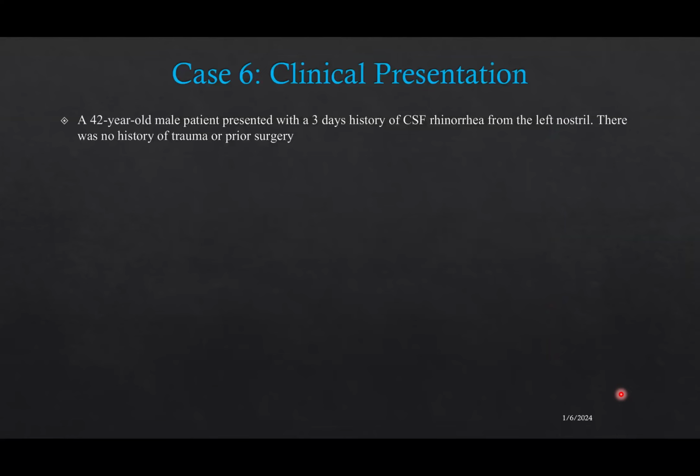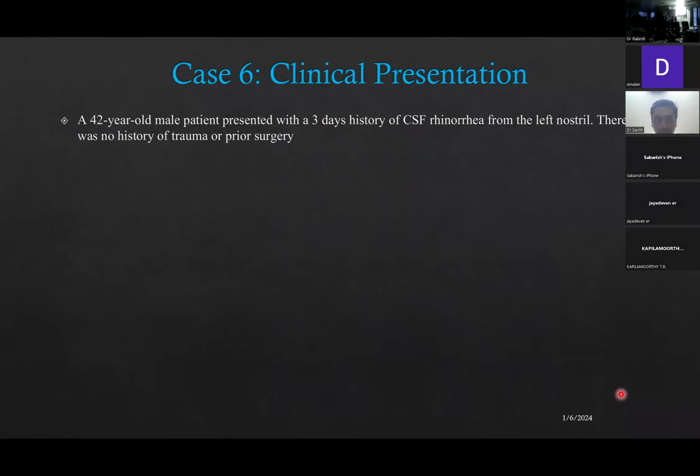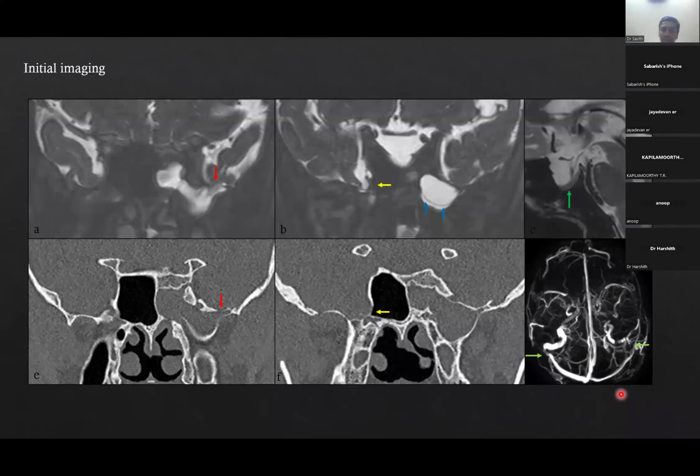So coming to my last case, this is a 42-year-old male who presented with a 3-day history of CSF rhinorrhea from his left nostril. There was no history of trauma or prior surgery. So this is his first MRI.